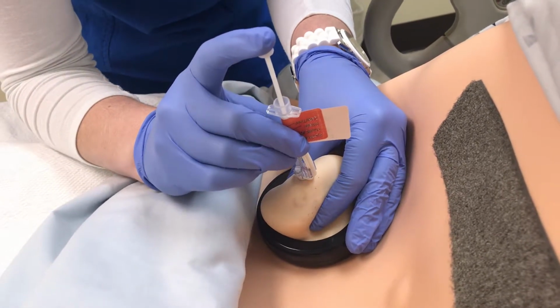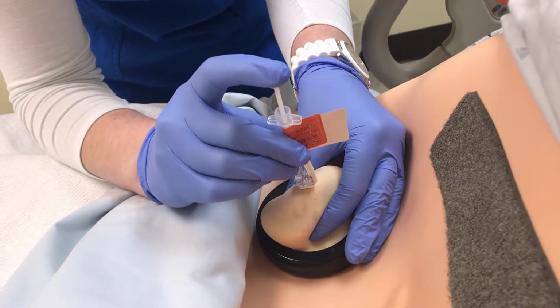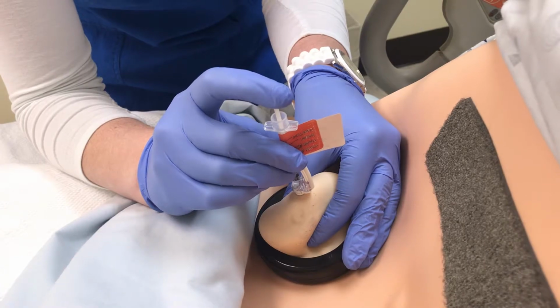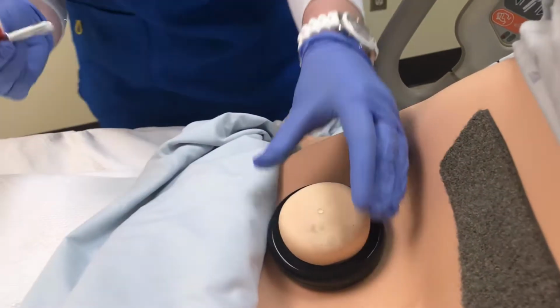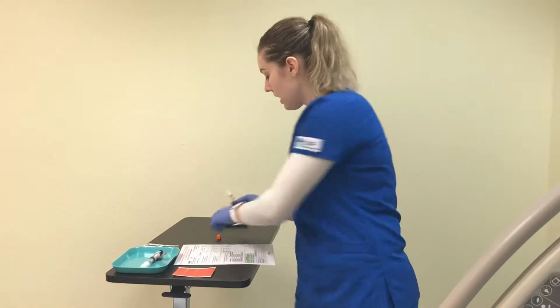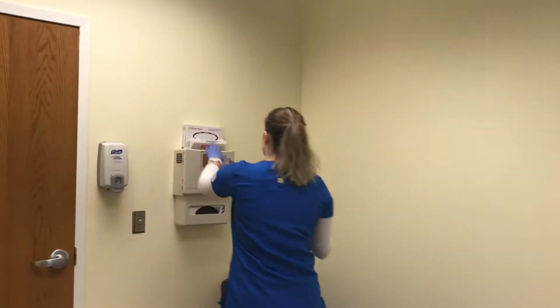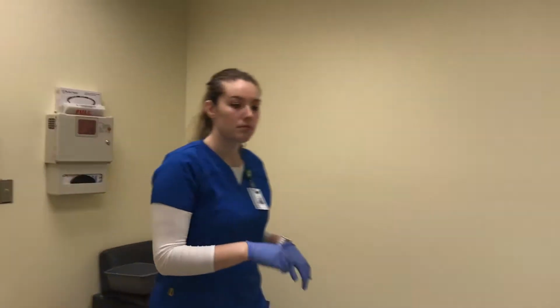I'm just going to inject it slowly because it can burn, while continuing to pinch the skin. Okay, and then I can pull it out, and I will hit the safety on my needle, and I will throw it out right away into the sharps container.